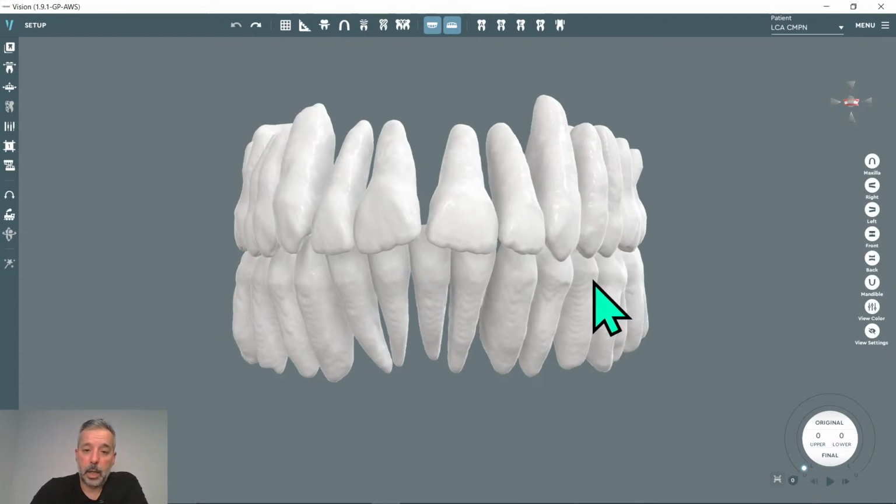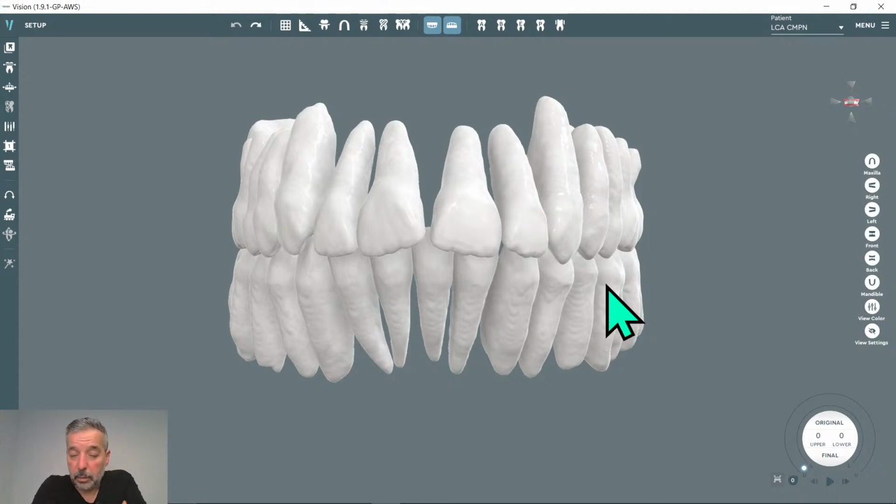Basically, some part of the SoftSmile software is installed on your PC, but a lot of the software is in the cloud, for example the database and everything. That is easy for you to work on your PC because the software is not heavy, and also to manage the software is not difficult. It is also safe because all the data is in the cloud, everything is saved, and everything is under control.